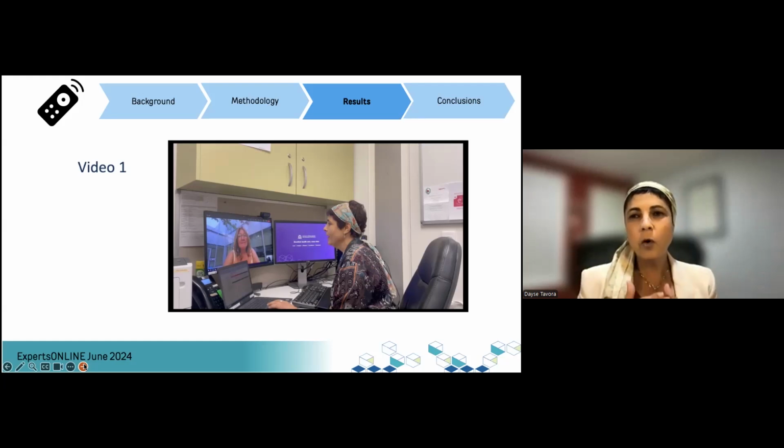We organize an appointment. It is still a video call, so the patient has the facility to help with lip reading, but the patient is at home. So we are removing all the other steps. We organize an appointment the same way as before, but it's a video call, and the patient is doing everything with us on the screen. So we remove the traveling, we remove the equipment, but we are still doing everything that we need to do with this patient.